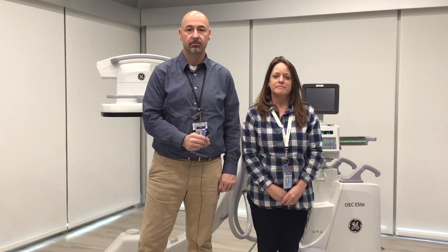Hello, my name is Rebecca Hammond. I'm a Clinical Imaging Specialist with GE OEC. And I'm Sean McClemon, Clinical Imaging Specialist for GE Healthcare Surgery. We're going to show you some of the brakes and locks on the C-Arm to help you with positioning for your surgery cases.